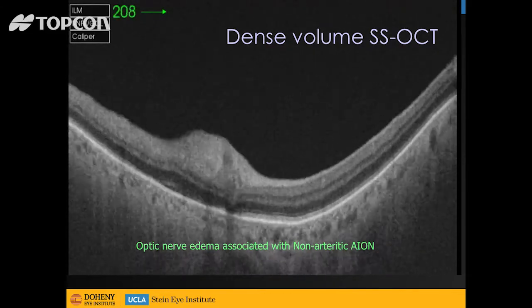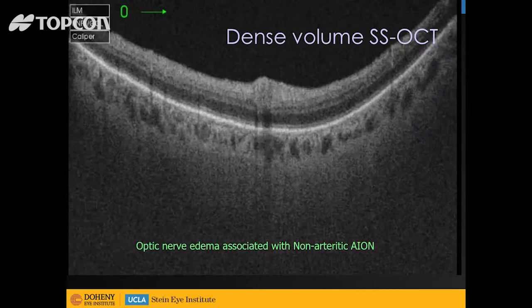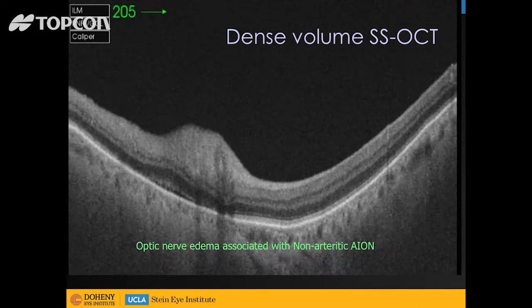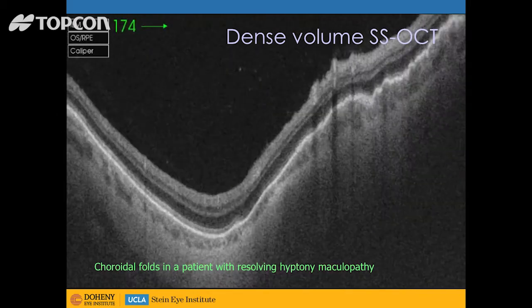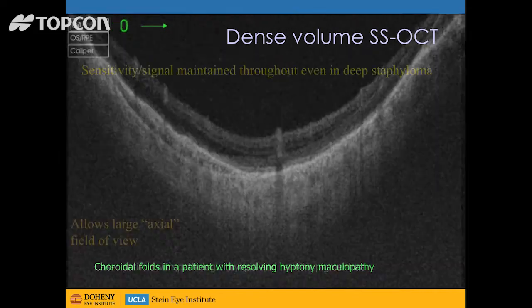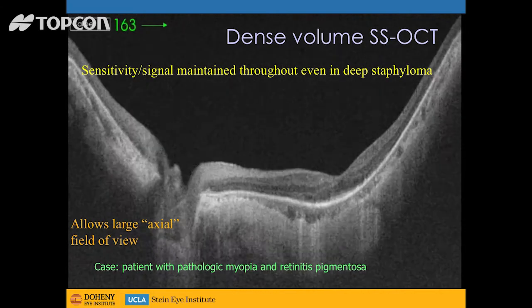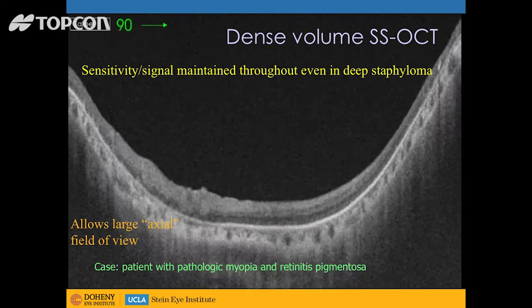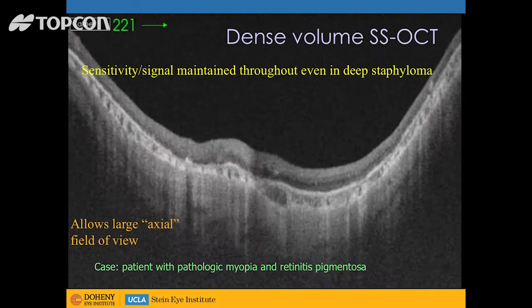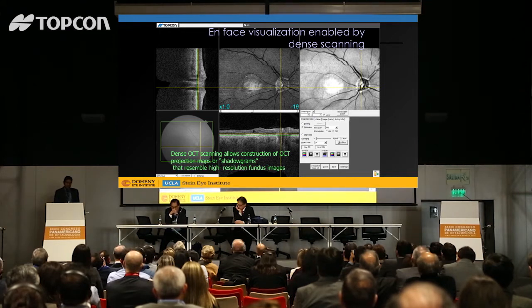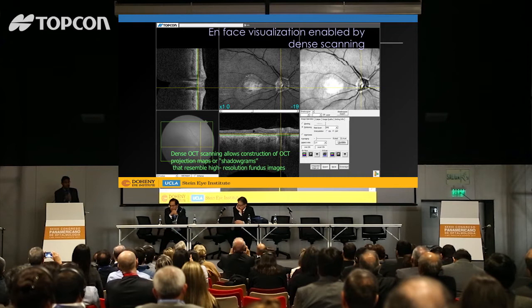This is another patient with anterior ischemic optic neuropathy. With swept source OCT, we can actually see the subretinal fluid below this edematous nerve and visualize even the choroid below this massively edematous nerve — again emphasizing the advantage of good signal despite depth. These are all on-average volume scans. Here's a patient with hypotony maculopathy. Another advantage we've seen is in patients with high levels of myopia — we're able to get imaging into the depth of the staphyloma. Note that the signal is pretty good in the anterior retina and quite similar to the posterior aspect of the staphyloma.